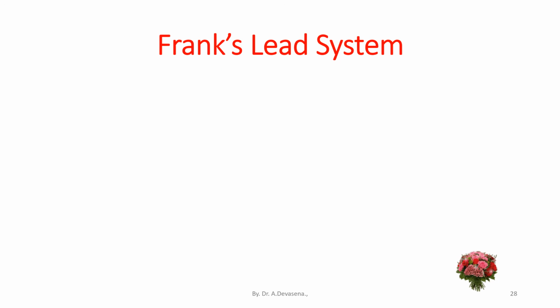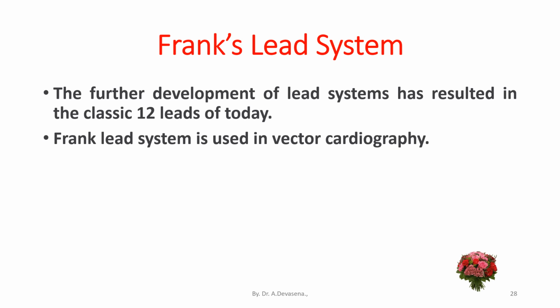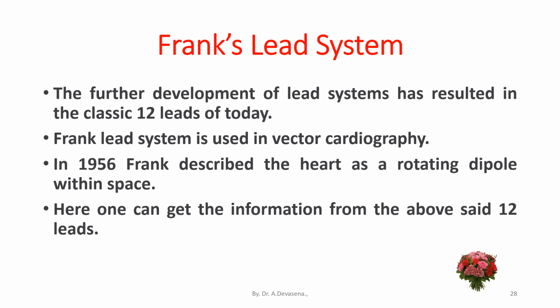Frank lead system. The further development of lead systems has resulted in the classic 12 leads of today. The Frank lead system is used in vectorcardiography. In 1956, Frank described the heart as a rotating dipole within space. Here, one can get the information from the above said 12 leads.